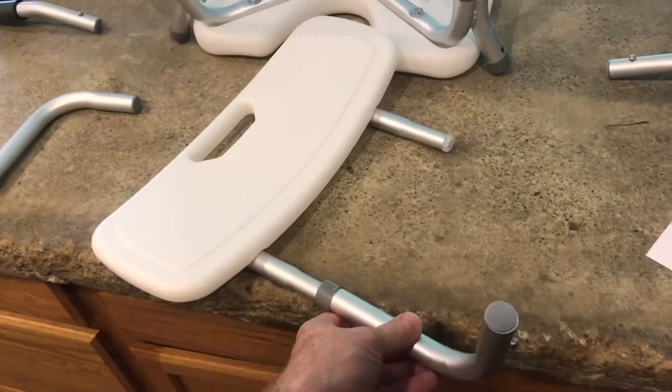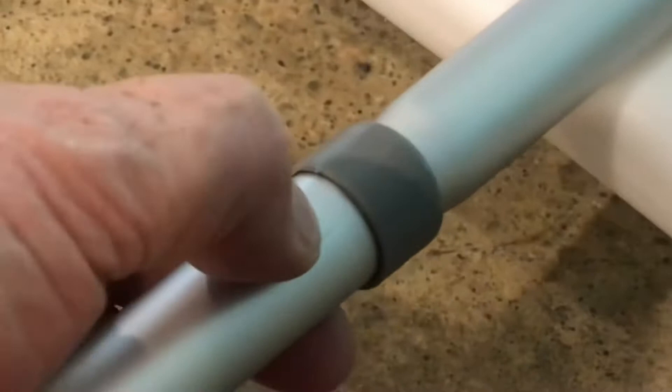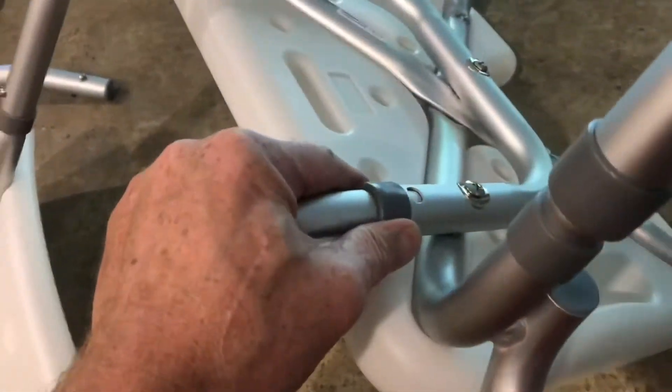We'll put the back of the seat together. The tubes work in the same way — everything locks into place around this nib. Snap the backrest onto the chair. It's nice that all the fittings are the same.